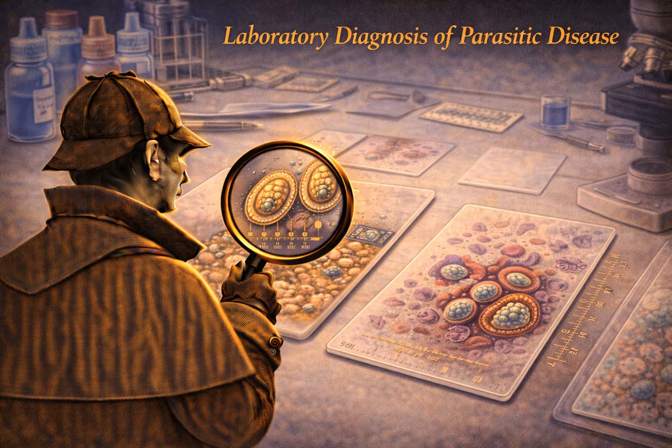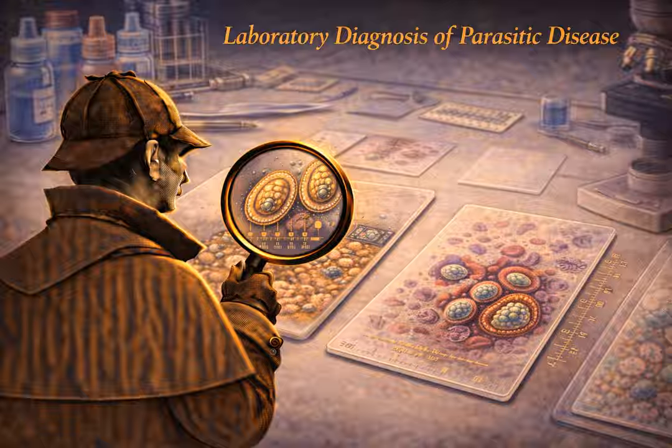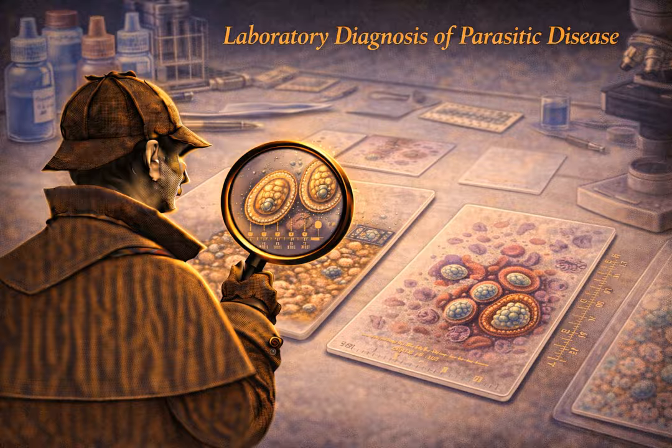And what about the earlier stages, the ring stages? Falciparum is aggressive. You very often see multiple rings crammed into a single red blood cell, sometimes 2 or 3, and they look delicate, like little headphones. You also see the applique form, where the tiny ring parasite looks like a blister stuck on the very outer rim of the red cell membrane. And crucially, biologically, falciparum is not picky. It will infect red blood cells of all ages. Therefore, the infected red cells look like a totally normal size compared to the uninfected ones around them.